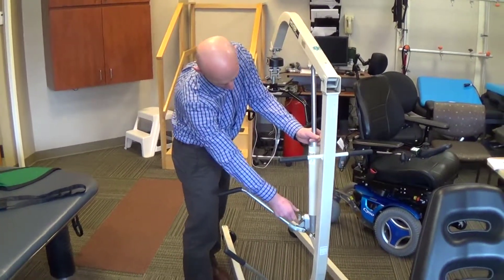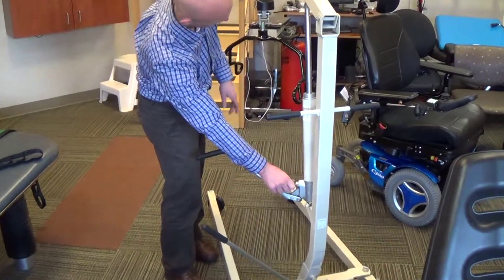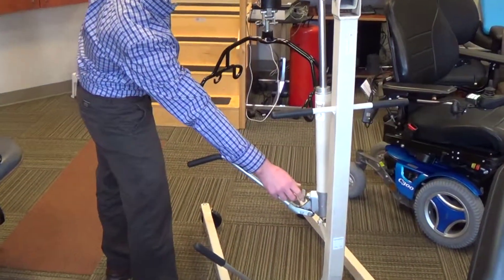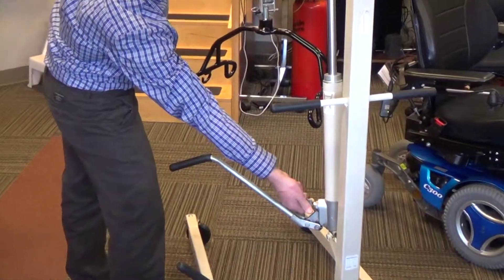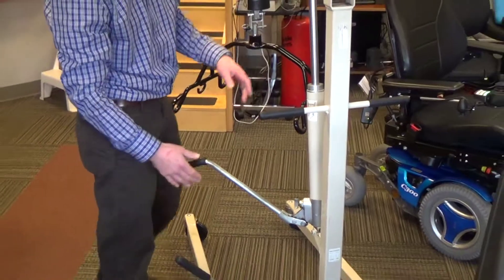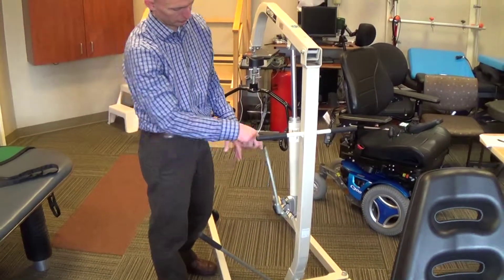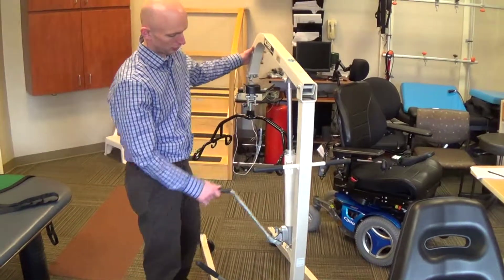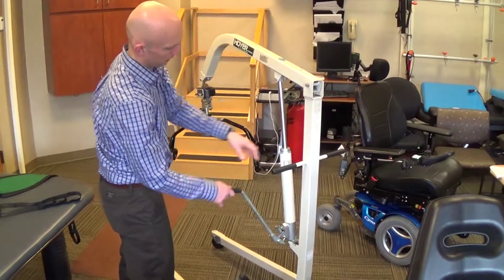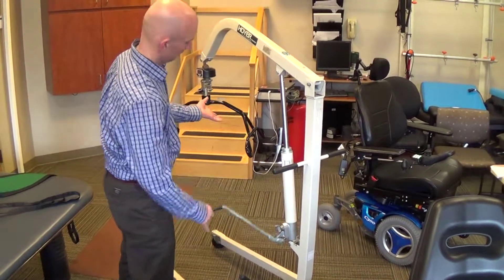There is first a knob that is used to lower the lift and then lock when you need to raise the lift back up. This is the handle for the lever arm, used to pump the lift to get to the desired height.